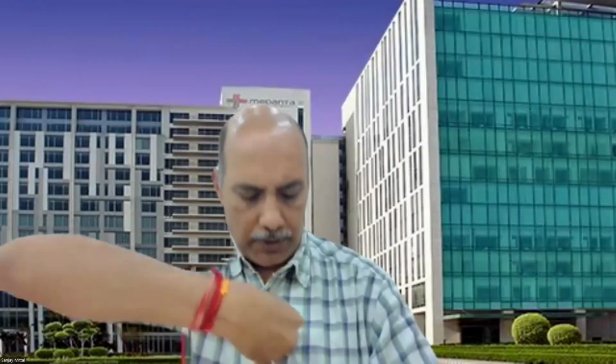Dr. Kamal: Sir, if we do not have a proper view like foreshortening, then definitely we will make mistakes in calculating the dyskinesia or akinesia, like things. Absolutely. But if you are vigilant enough and learn to look at all the views, even the short axis view, when you have a parasternal long axis here and you rotate the transducer for a short axis view, you should look at all the segments, the basal, mid, and apical segments. From this particular view itself, you'll have a fair amount of idea what you're looking at.